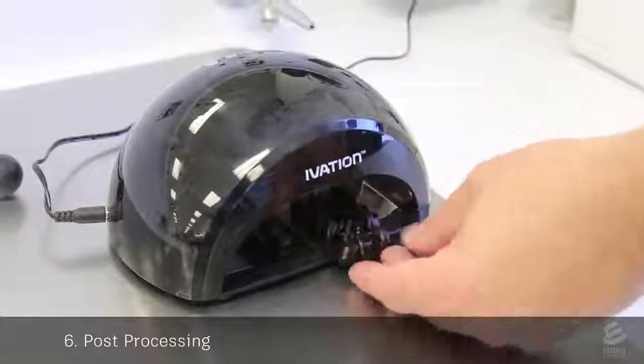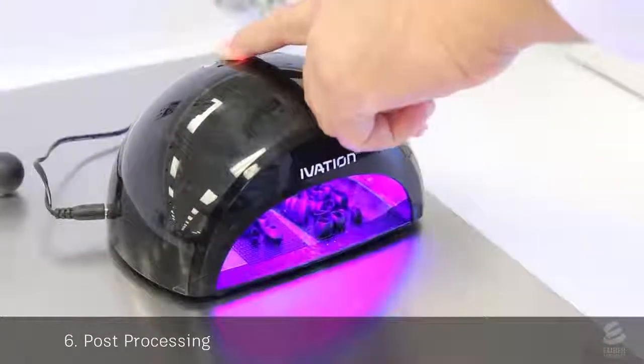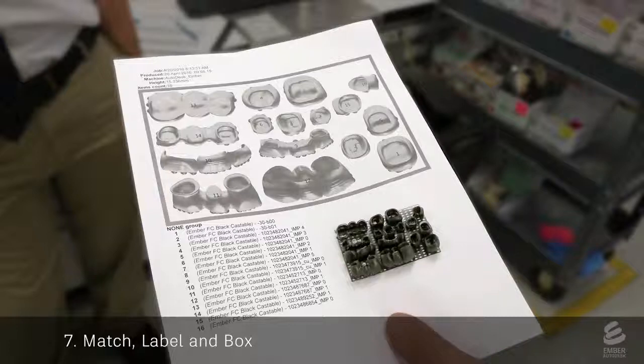Then the print goes through a post-curing step under a UV lamp. Because the print can have multiple crowns from multiple patients, they create a sheet for each print. The sheet has an image that matches each crown and coping on the print with a specific patient.